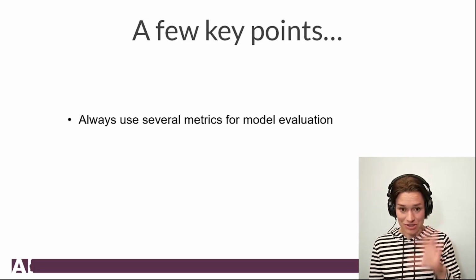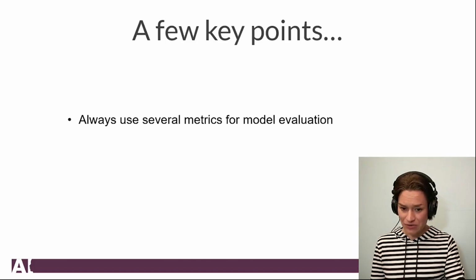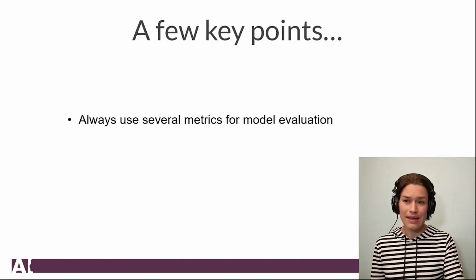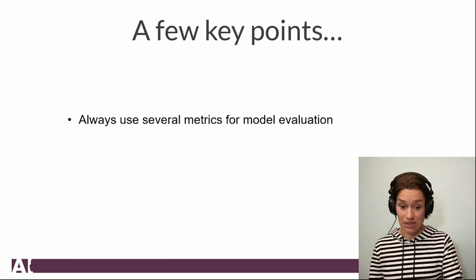And the mathematicians would give you a lot of potential evaluation metrics. I am not a mathematician, so I will only talk about a few that I think are crucial for us to understand so that we can compare models to each other when we are developing them. We can look through literature and see, okay, is it actually good performance or is it not really good performance? But anyway, important thing, always more than one metric.